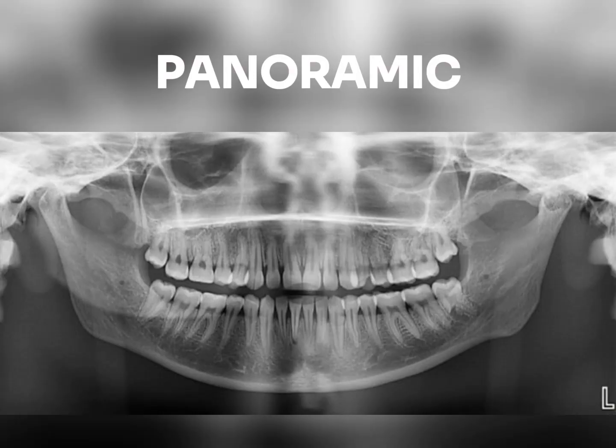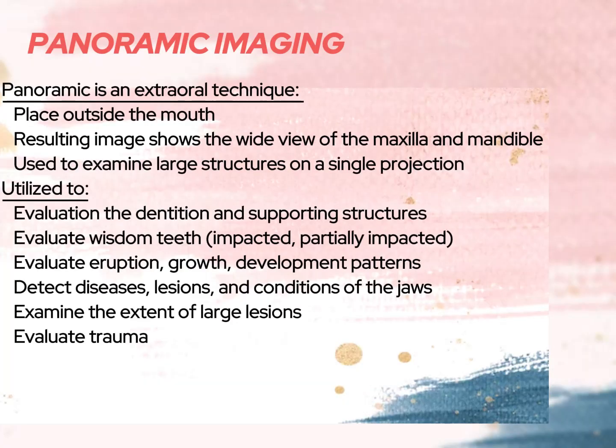In this video, we are going to walk you through the panoramic radiograph exposure process, including the basic introduction of the panoramic machine and panoramic radiograph evaluation. Panoramic imaging is an extraoral technique, and the resulting image shows a wide view of the maxilla and mandible, used to examine large structures on a single projection.